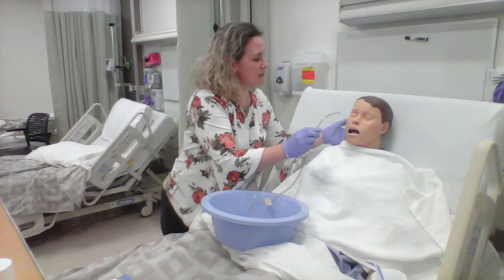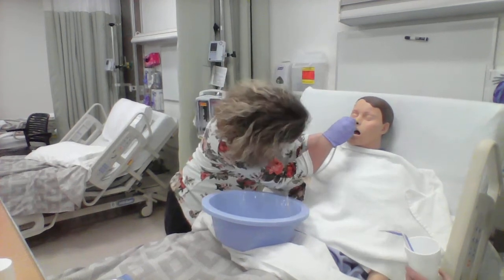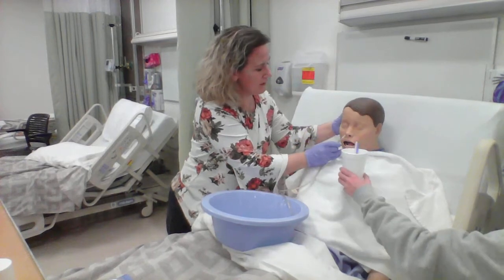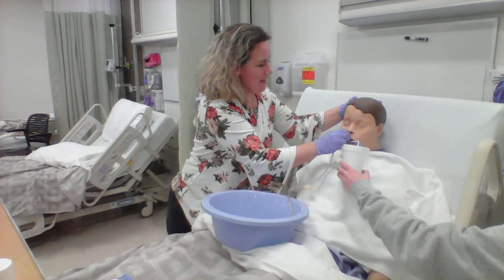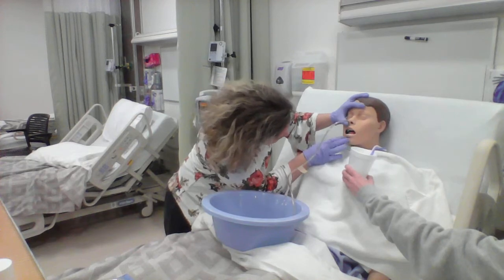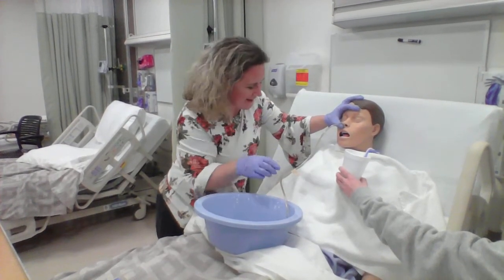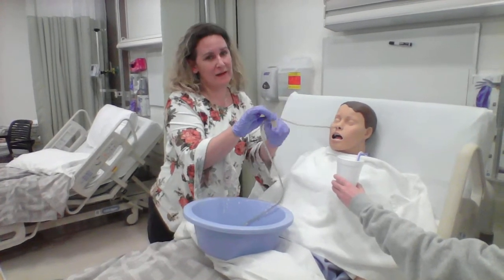Patient states yes. We're going to go ahead and start to insert. And here we are at the back of the throat. So go ahead and tilt your head forward. Take a drink, and we're going to keep pushing it. And that's as far as the mannequin will let me go. We're going to check with the pen light, with the tongue depressor. We would go all the way to the tape, but the mannequin won't let me do that.